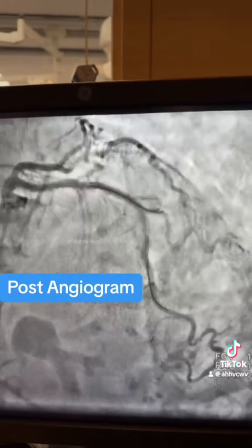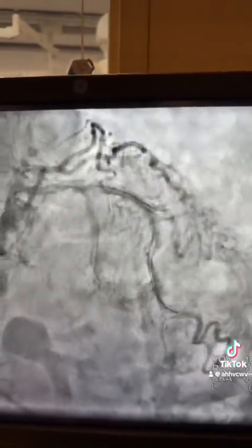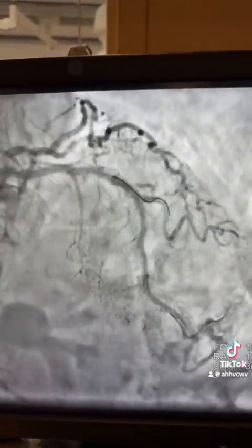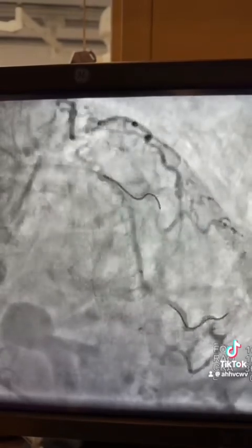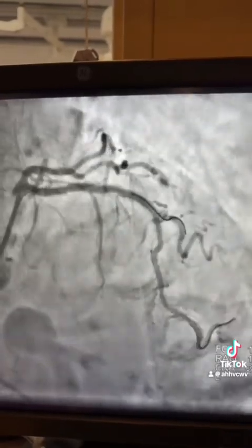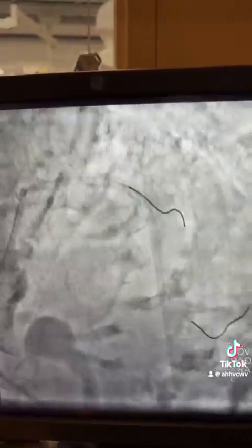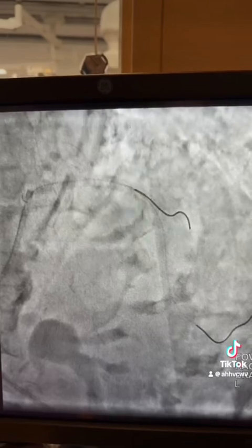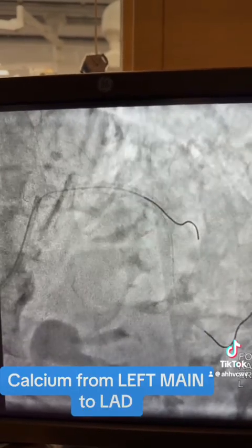Six runs for the LAD and two runs for the diagonal. Here is the angiogram post-shockwave and before placing the stent. Decent results in the diagonal, and as you see here, the main vessel is heavily calcified.